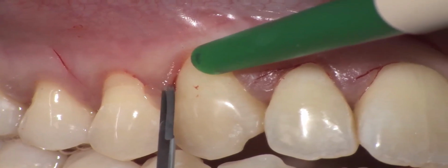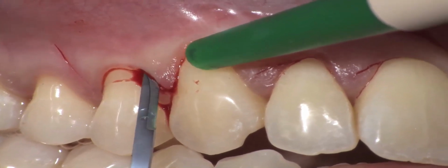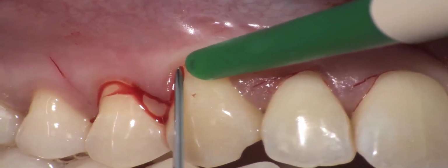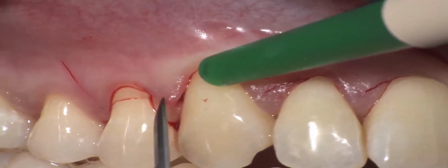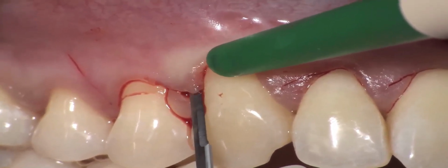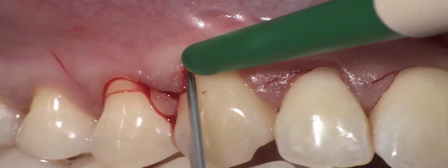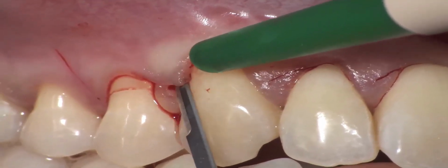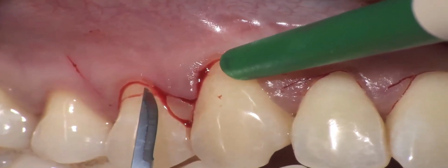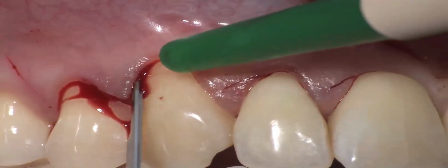Once the tip is done, this is the contour of the tip. We have only one tip in a triangular shaped papilla. Is it possible to use my knife parallel to the soft tissue and complete papilla elevation split thickness? Papilla elevation split thickness ends in the probable area of the first premolar.